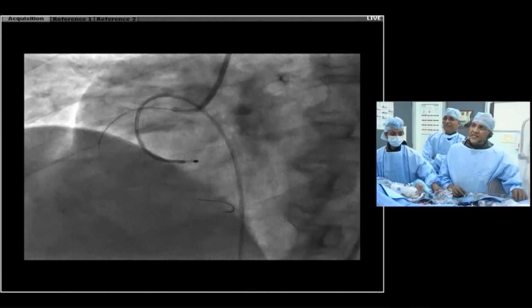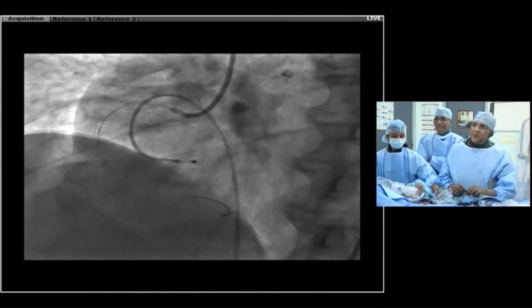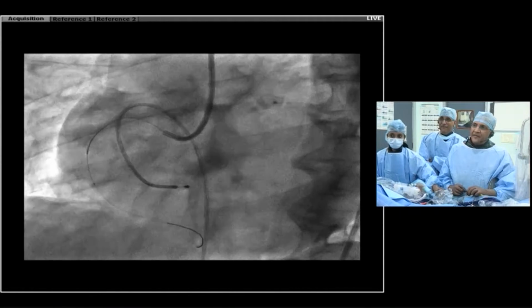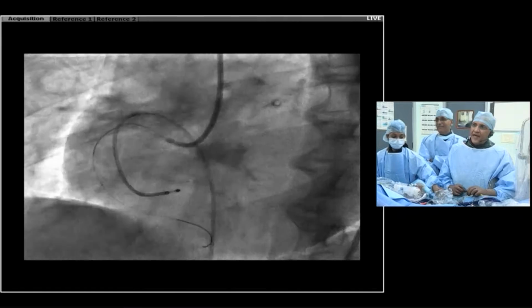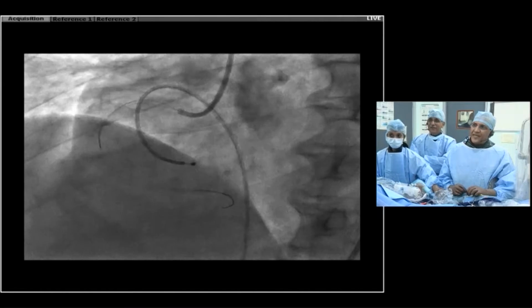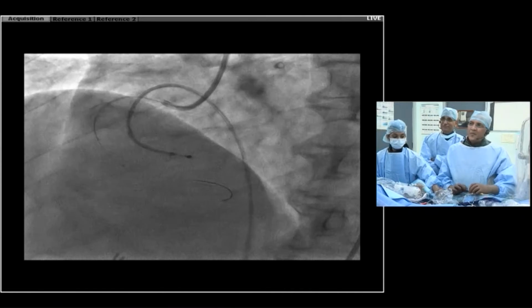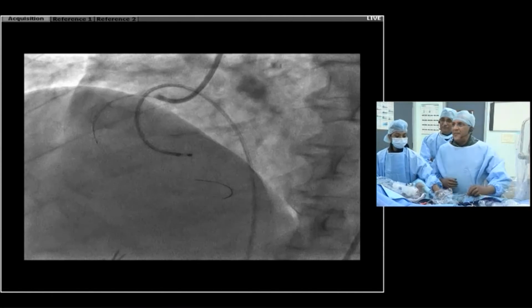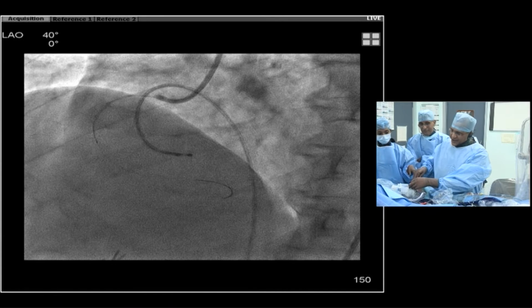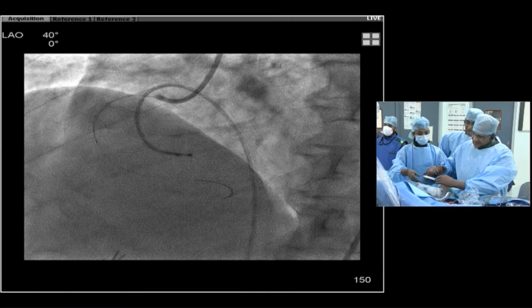So Ajay, this is something else that I've learned in these calcified RCAs: sometimes just keep a sustained pressure on that IVUS catheter and it'll keep going forward a little bit rather than trying to push it. Yep, and it makes your life easy. You can see that IVUS catheter just progressing, moving slowly with every beat. But don't over push, because for other people, when you shove too hard, you'll kink the imaging catheter, and then it gets stuck and then it's a disaster.